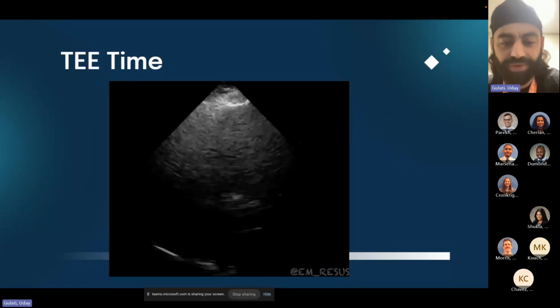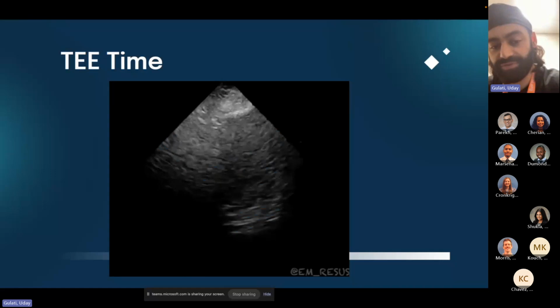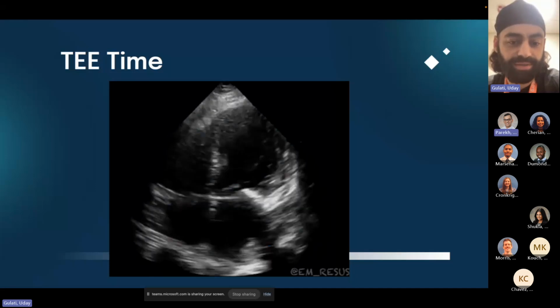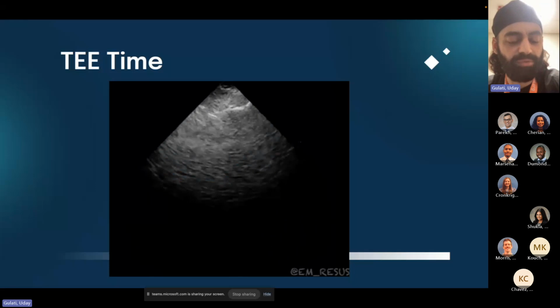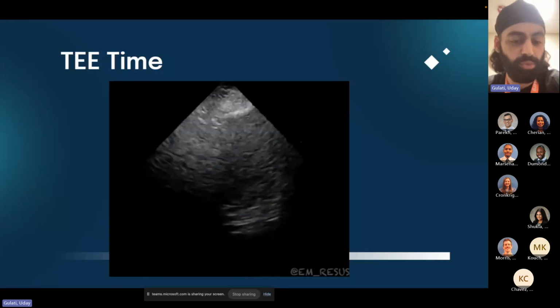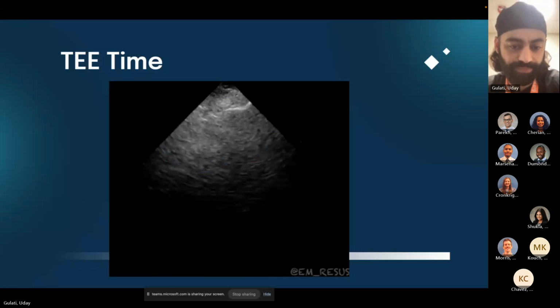And what you want to try and figure out is, are you getting blood flow out of that left ventricular outflow tract? I'd actually be concerned about this patient because I'm not seeing that left ventricle squeeze. Yeah, it looks the exact same as always. Yeah, I'm concerned that maybe I'm not over the heart, right? I want to tell the person doing CPR to adjust their chest compression so that they go maybe more over the left chest, and I want to start seeing that LV squeeze, right?